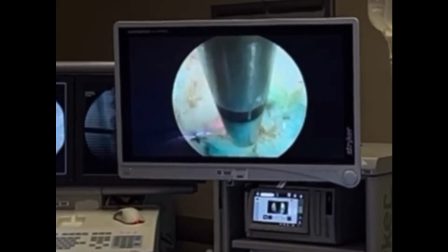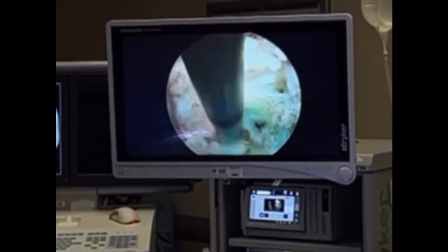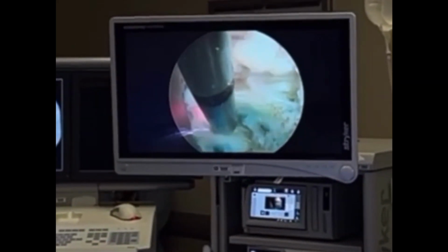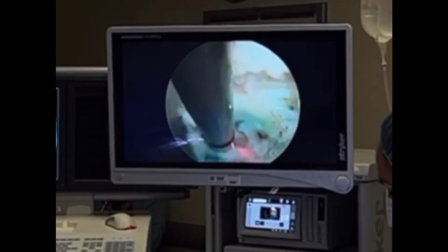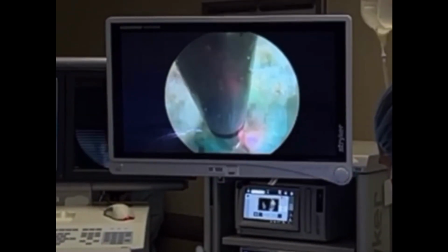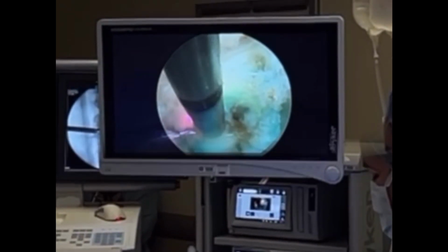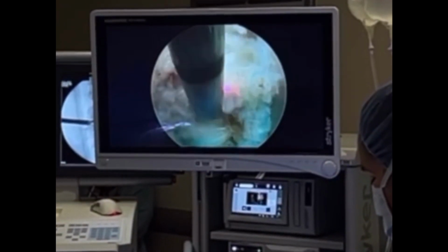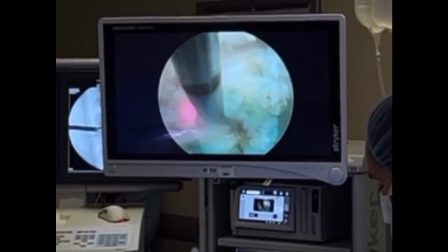And more importantly, the Elman probe is an electrical device. Electricity can shock a nerve and conduct through tissue. A laser is non-electrical. It's almost mechanical. So I don't know if you can hear this tapping. It goes when I used to do the surgery with a patient awake, they would be like, "What's that tapping?" Because it's a mechanical event. That light, which we call photon energy, is mechanical. And I can feel it tapping right there. But I can get right next to a nerve and work without fearing that it's going to conduct electrically.